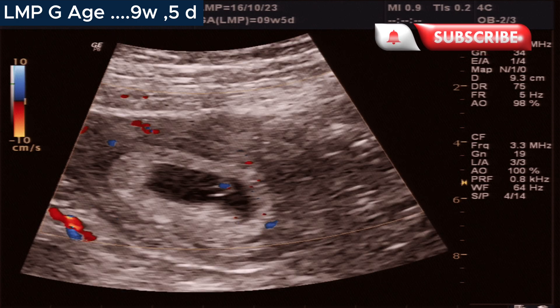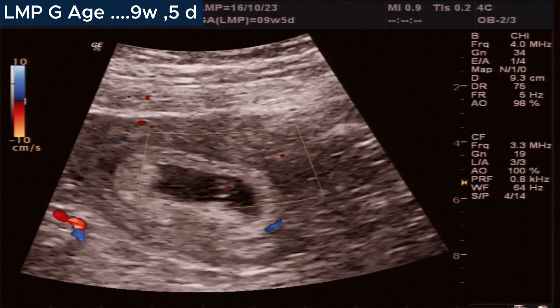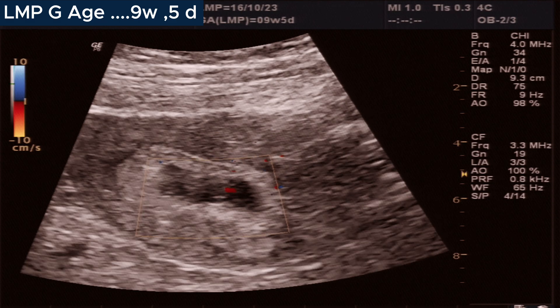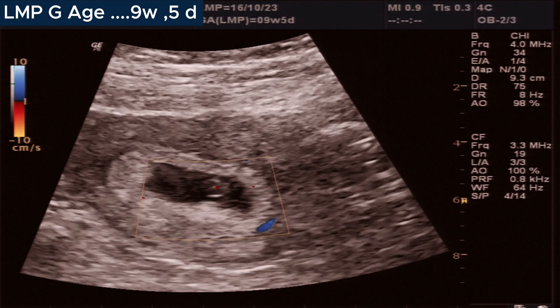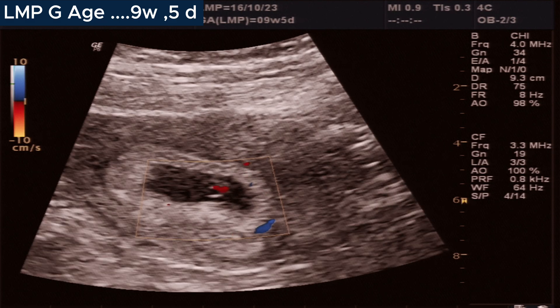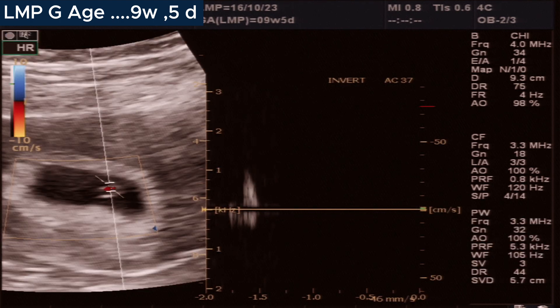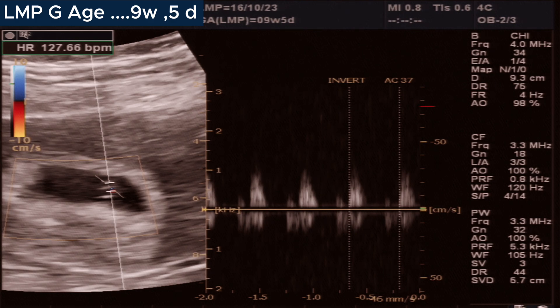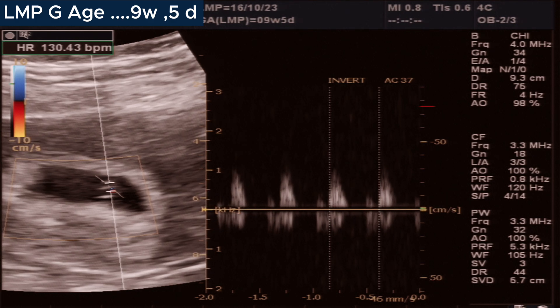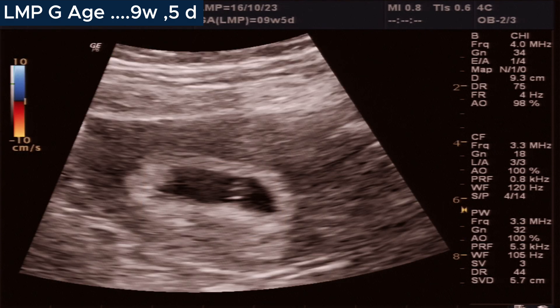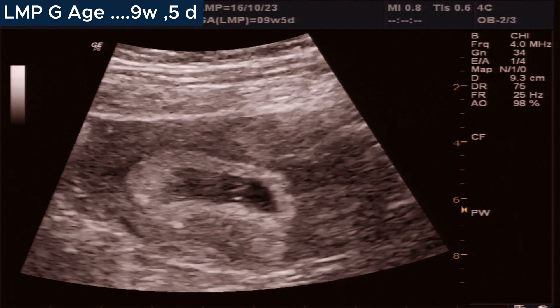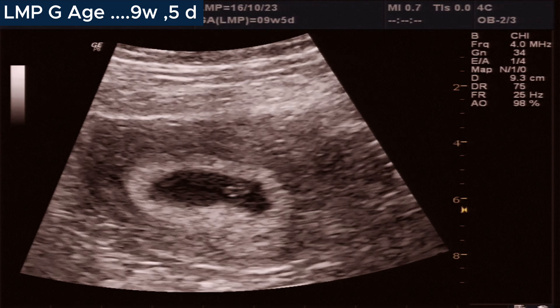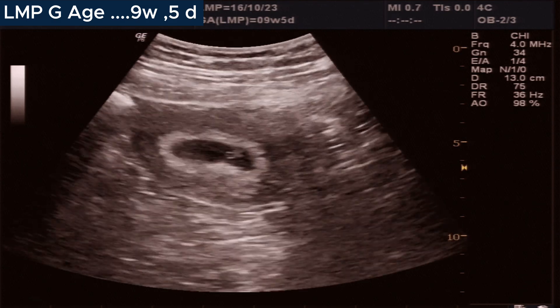In summary, every parameter in this first trimester pregnancy scan is normal — this is a 6-plus weeks normal, alive pregnancy. Regarding the LMP date of 9-plus weeks, this appears to be a forgotten LMP date by the mother. A follow-up scan was suggested, and the follow-up scan at 12 weeks of pregnancy was normal.